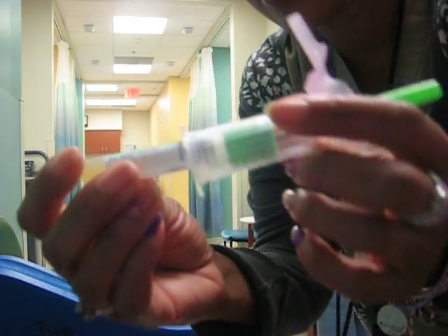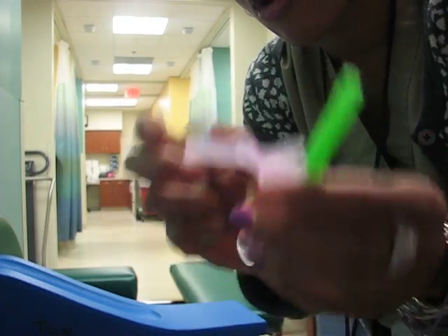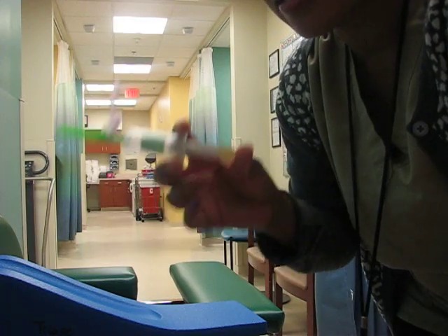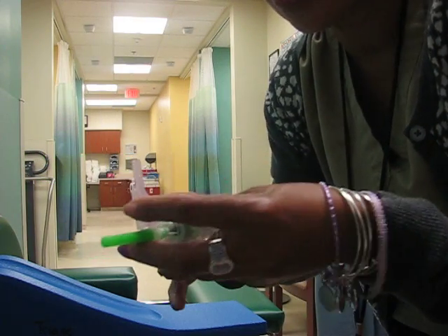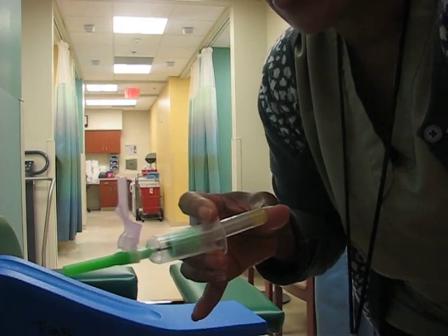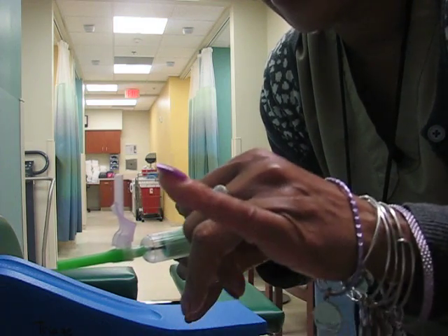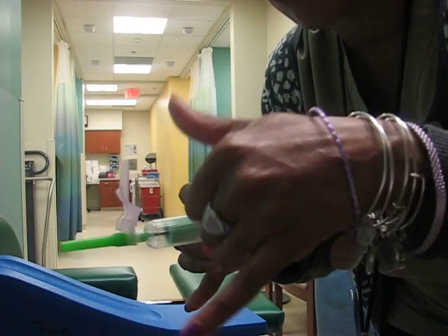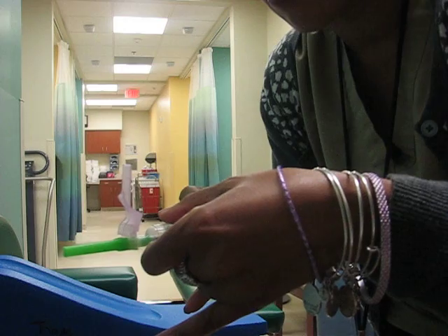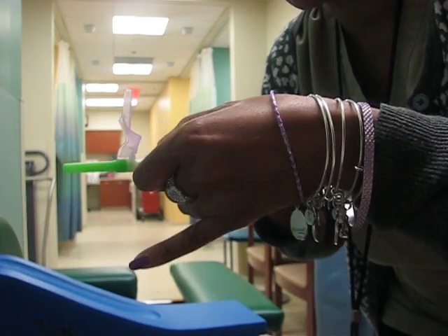See those little feet? I've tried to tell you guys — use these feet, they're there for a reason. They will help you with stabilizing your needle. This is stabilizing my needle. Once I puncture the vein and I'm in the vein, I put my hand here: my pinky is on the outside of the patient's arm, and my thumb of course is on top of the vacutainer. This is how I stabilize my needle.